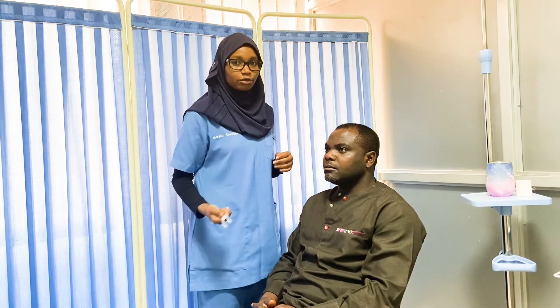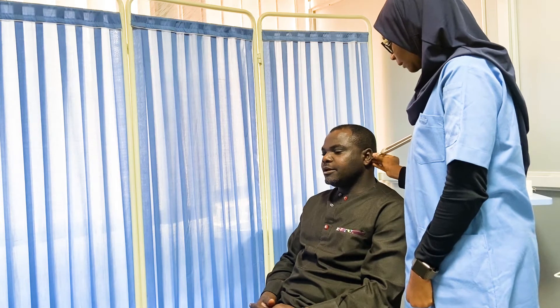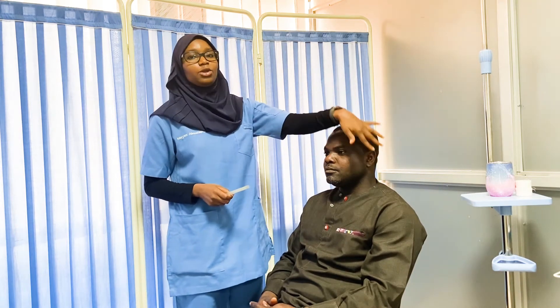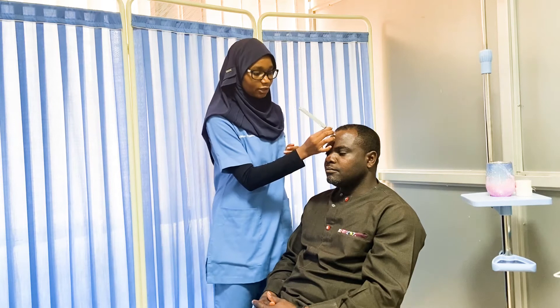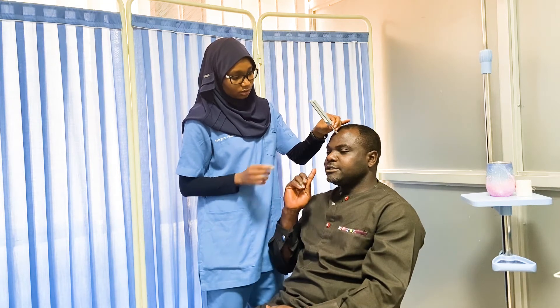Now we perform the Weber test on this patient. The patient can hear the tuning fork. Is it the same on both ears or louder on one side? It's louder on this side. So the patient is hearing it, but the sound seems to be louder on one ear, meaning it is lateralizing into that ear.